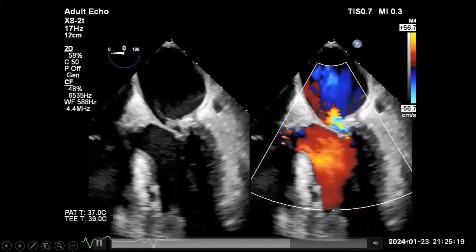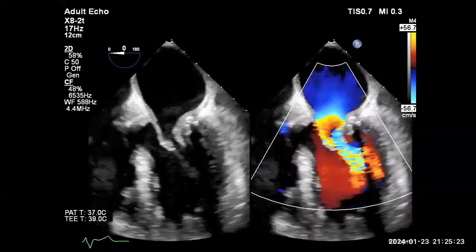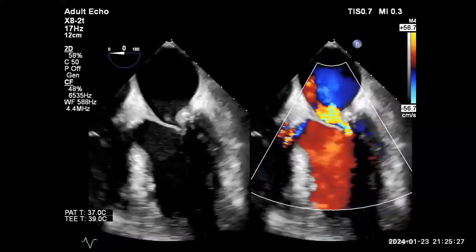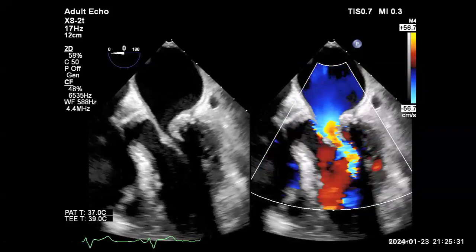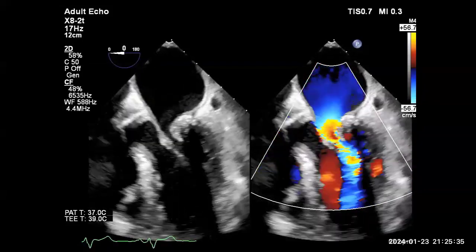So the cases of infective endocarditis are very important in the exam. And why am I expecting a TEE if there is something? Because you know most of the cases will be missed by the transthoracic and will be diagnosed from the TEE.